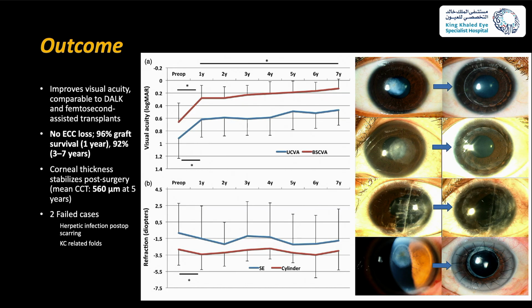So from the outcome point of view, it's noted that the visual acuity of the HALK procedure improved significantly over the first year and continues to improve over 7 years. This applies also to refractive outcome.